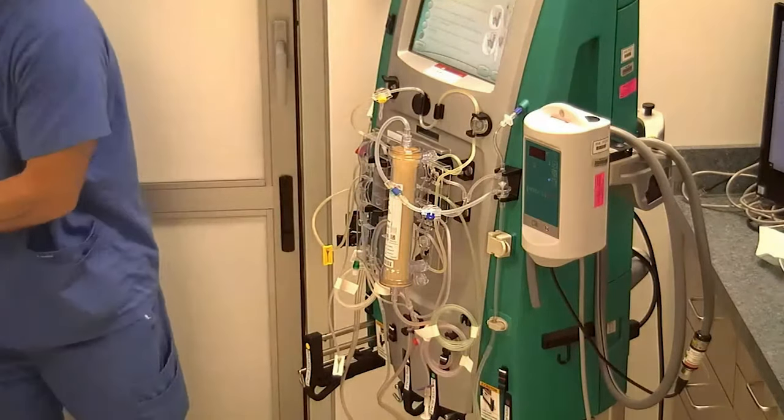If we let the blood level get too high, there is a mesh filter here in this little square piece, and if that becomes wet with blood, then this filter cannot function any longer. So your blood will still turn in the blood pump, but the machine cannot perform therapy anymore. You'd actually have to take all of your tubing off and put a new one on. So it's good to keep that blood level right where it needs to be. So we've adjusted our chamber. We're going to go ahead and hit continue.